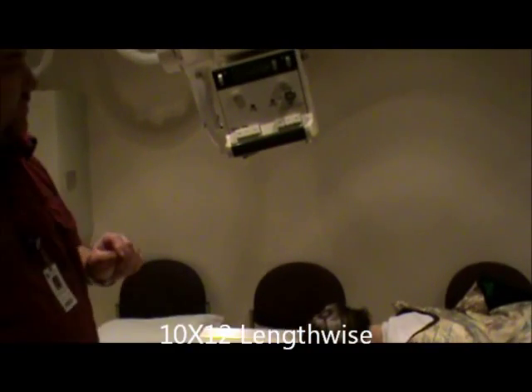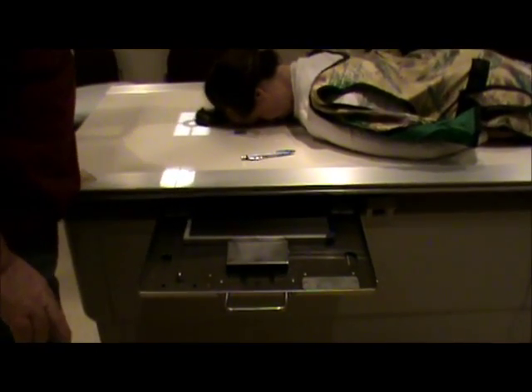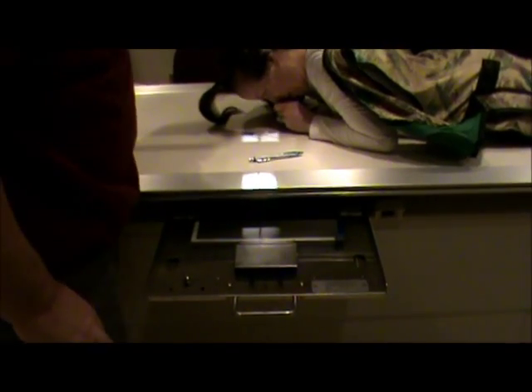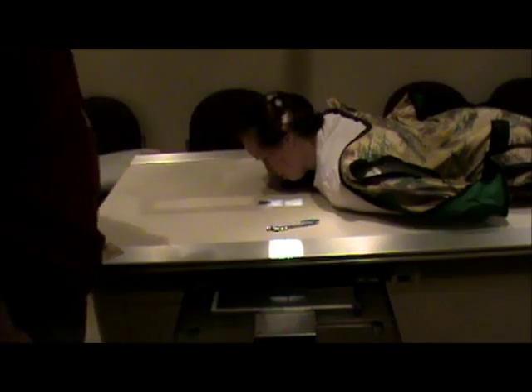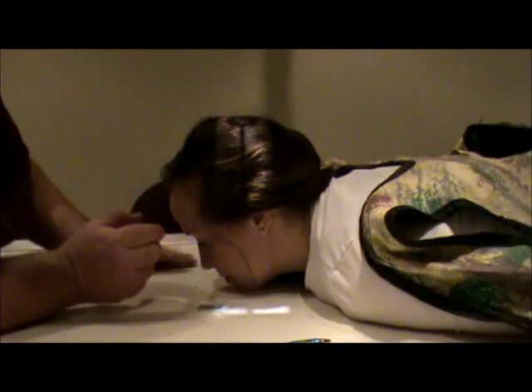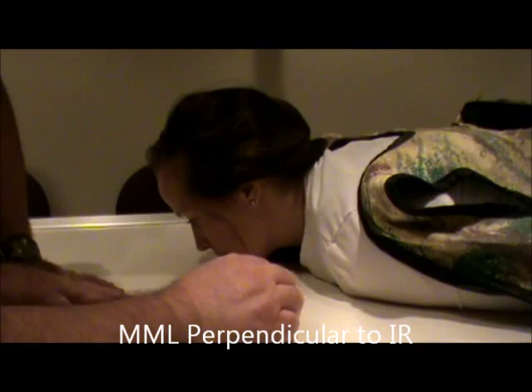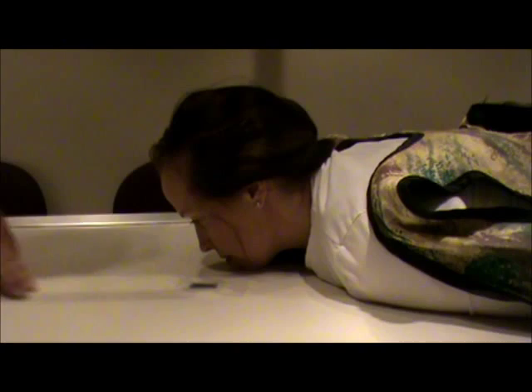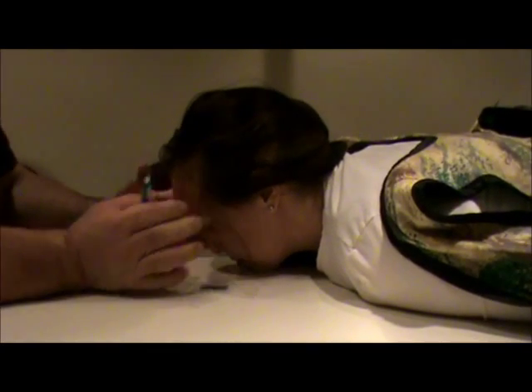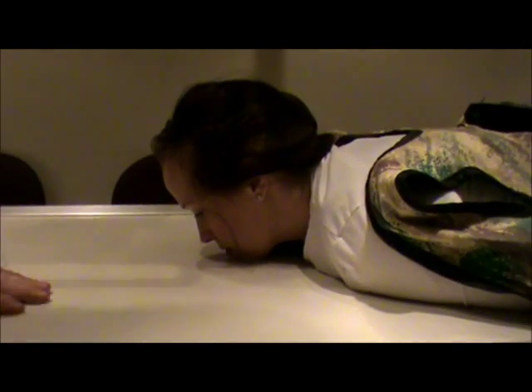Now we're going to do our Waters view. I'm going to take the angle off and re-center to my film. Then we're going to have the patient put their chin on the table and tuck the chin down just a little bit. I'm going to try and get the MML perpendicular to the IR, and make sure her head is straight. I'm going to place my pin to show that we're going to exit at the level of the acanthion.